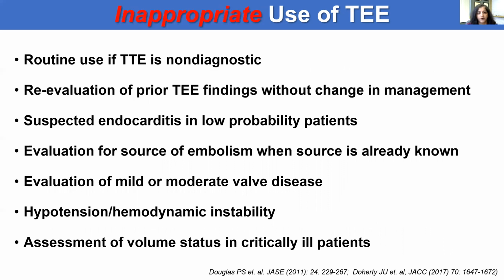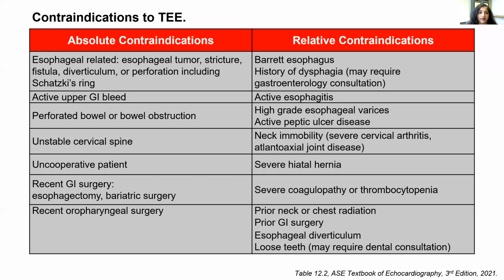Equally as important as appropriate use of TEE is inappropriate use of TEE. TEE is not indicated if the TTE is non-diagnostic and the findings would not change management. It's not indicated in low probability endocarditis patients, and it is not indicated for the assessment of volume status in critically ill patients. These are the contraindications to TEE divided into absolute and relative contraindications.